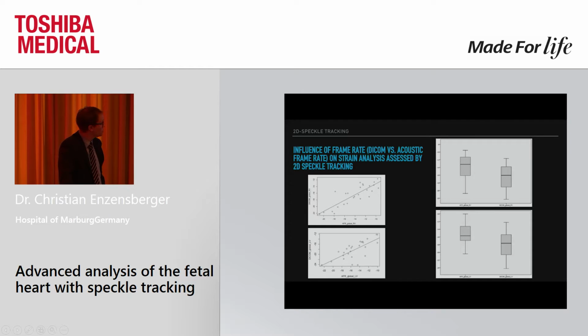We could show that the peak longitudinal strain values analyzed at the acoustic frame rate were a bit lower. The distribution was a bit lower with the acoustic frame rate, but it was not significant.